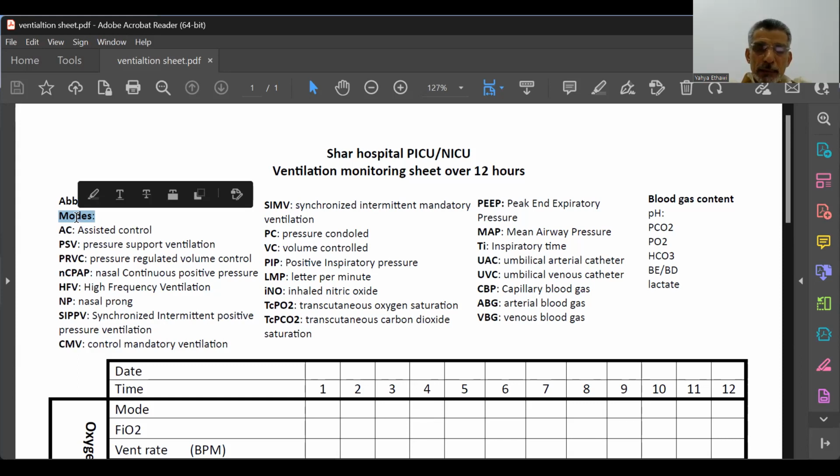There are other variables called dependent variables. These variables are the interaction between the baby and the machine, so they are also sometimes called measured variables. These are the variables that you see on the monitor of the ventilator. They are called dependent because they depend on the interaction between the baby and the machine. So remember, the independent or set variable is the variable that is set by the clinician or the nurse, and that's why it is called independent. So remember, we have phase variables, we have independent variables, we have dependent variables.